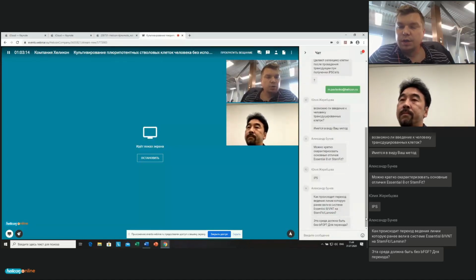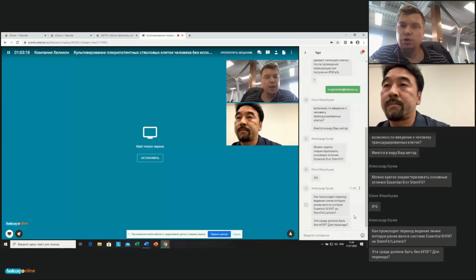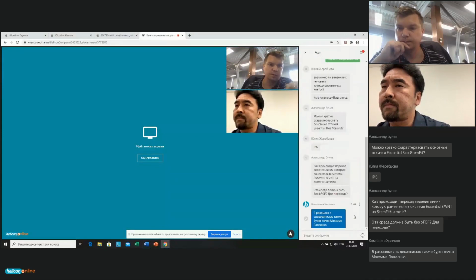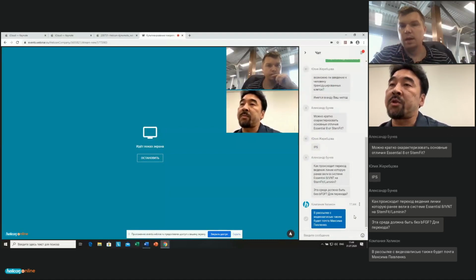Yes, Dr. Nakagawa, a question connected to the previous one. Do we need to use a StemFit medium without basic fibroblast growth factor or with basic fibroblast growth factor for the maintenance of iPS cells? Please use StemFit with basic FGF. Basic FGF is necessary for maintenance of pluripotency of iPS cells. Please use basic FGF.